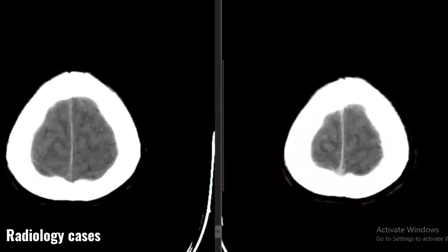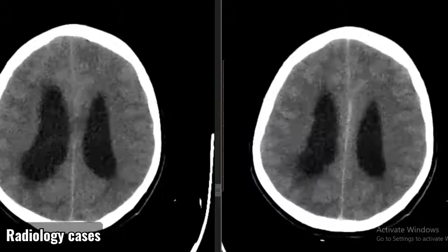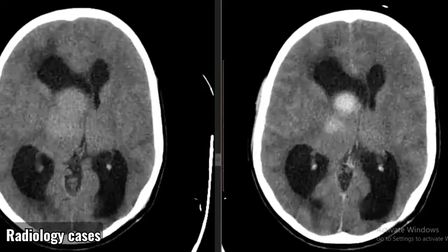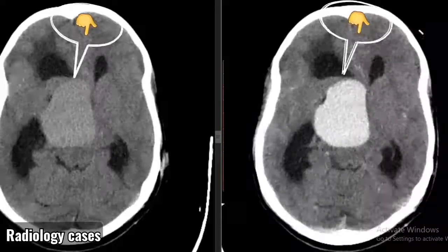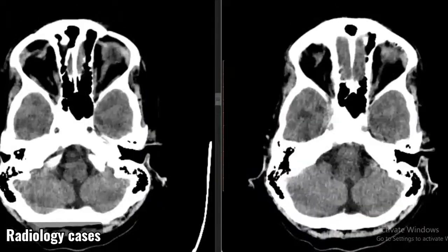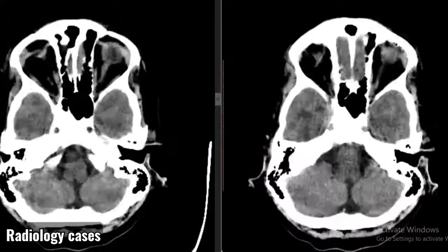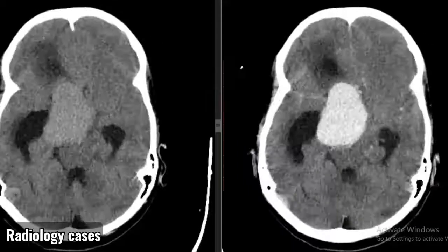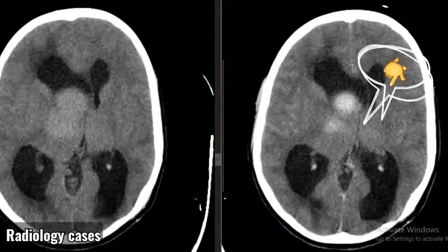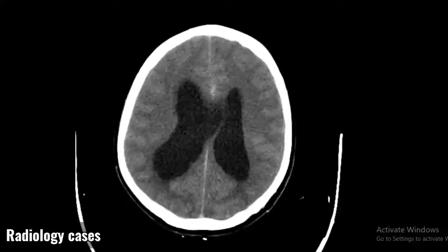CT brain case report, pre and post IV contrast brain CT follow-up images, compared with previous images. There is a 6 cm by 5 cm suprasellar homogeneous lobulated hyperdense, avidly enhancing lobulated lesion with expansion of the sella and intrasellar extension. The mass compressed the cerebral peduncles and the third ventricle, and caused a 2 cm shift of the cerebral midline to the left.